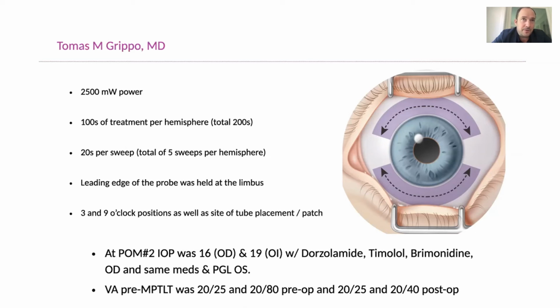It might have been different if the patient had an open angle, or neovascular glaucoma but stage 1, stage 2, where the pressures were not so crazy high, and I could have injected anti-VEGF, and then the neovascular membrane may have improved at the level of the angle. Then I could have considered MicroPulse TLT as a first option. So this is my case, Rob.